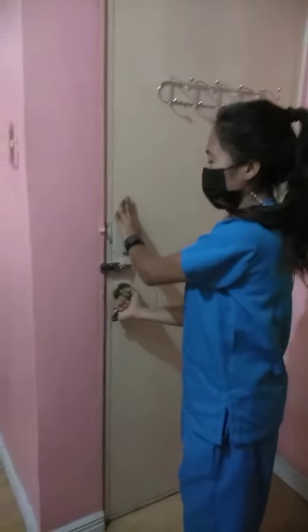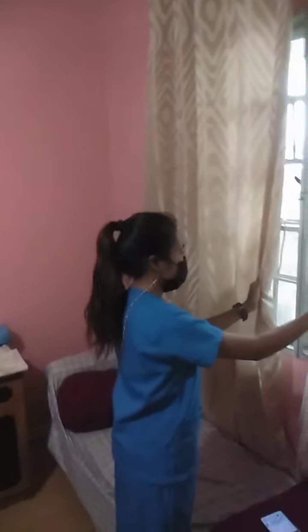Before performing nasopharyngeal suctioning, make sure the patient has no contraindication to the procedure, such as bleeding disorder, epiglottitis, nor laryngospasm. I will lock the door, fix the curtains for the patient's privacy, and don't forget to perform hand hygiene to prevent infections and microorganisms. So gather all supplies.